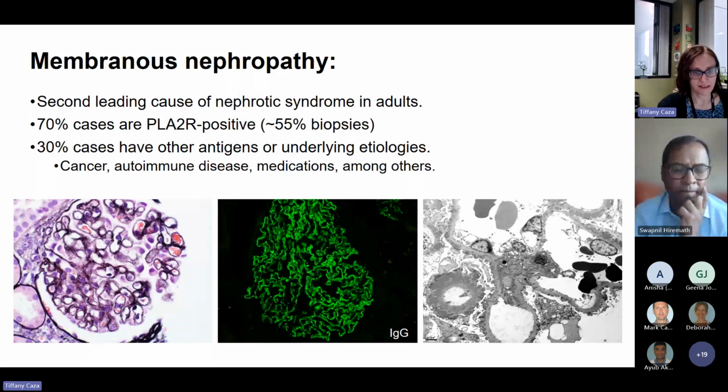On a kidney biopsy, membranous cases tend to have thickened glomerular capillary loops, of which you may see the presence of spikes or holes on silver stain. That occurs when the membranous is fairly developed. This is the same case where you can see here on the subepithelial surface, you have electron-dense deposits, but there is extensive glomerular basement membrane remodeling in intramembranous deposits, which results in that non-argyrophilia on silver stain.